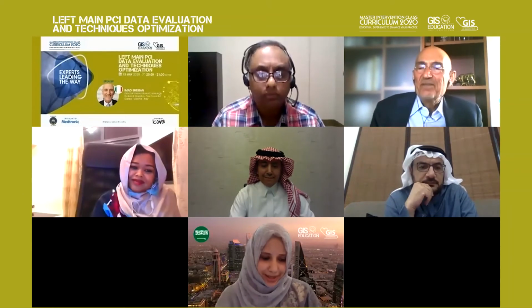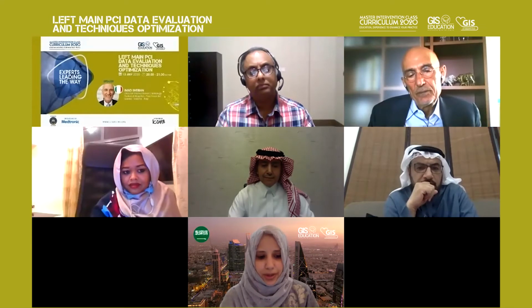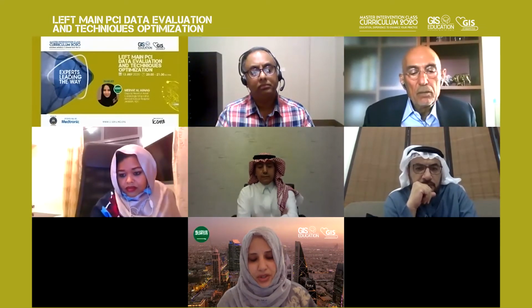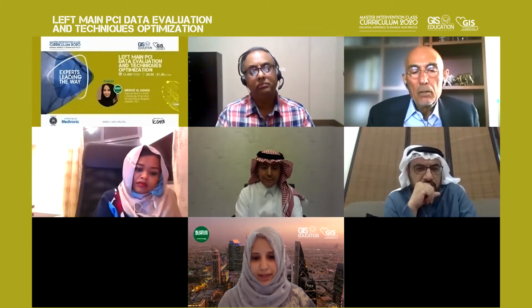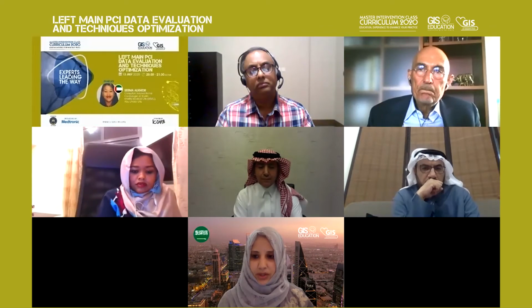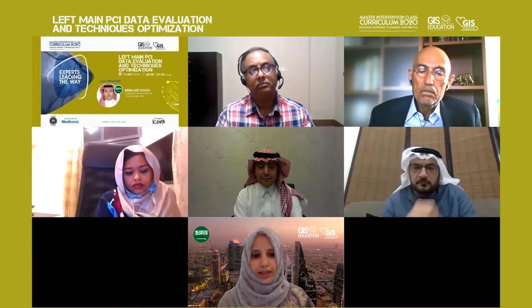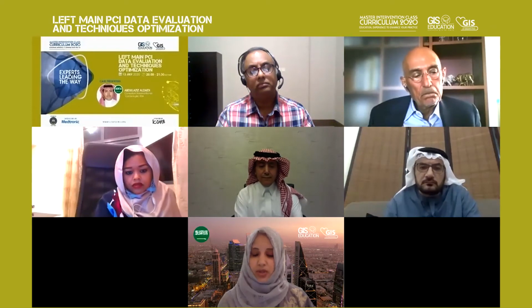So thank you, Dr. Abdulaziz, a very nice case. I think perhaps I'm just going to break it down for some of the fellows and the participants. I think it's usually wise to start more distally with the intervention and then move back. So conventionally, we would be starting with the LAD and the diagonal, and then moving back and doing the left main PCI in order to not inadvertently cause compression of the left main stent. So that would be point number one. Sometimes you can't do that.